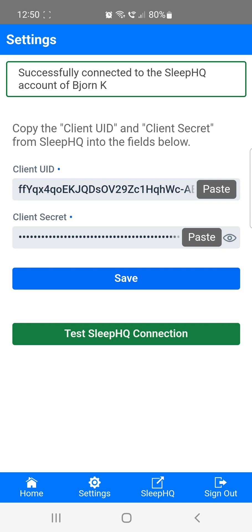Great! We've now successfully set up the Sleep Data app. This only needs to be done once, and the app will remember your credentials from now on. Now, let me show you how to share data from your O2 ring with Sleep HQ.